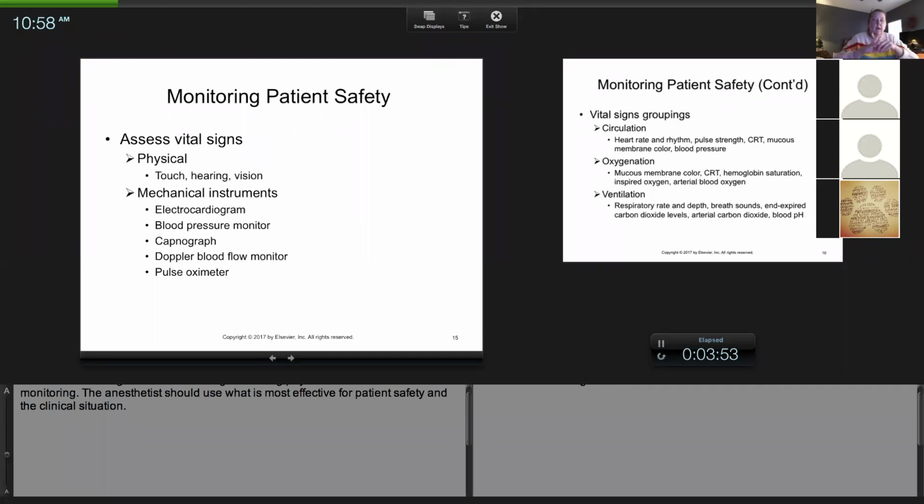And I think a common mistake that students get into, especially in surgery, is you tend to stare at the monitor and just look at your mechanical equipment. The student I was helping the other day, the ECG was kind of all over the screen because the student was scrubbing for surgery. So the ECG was moving, therefore the heart rate kept jumping. It was like 70, then 220, then 140. And she's freaking out, like, oh my God, I don't understand this heart rate. What is happening?